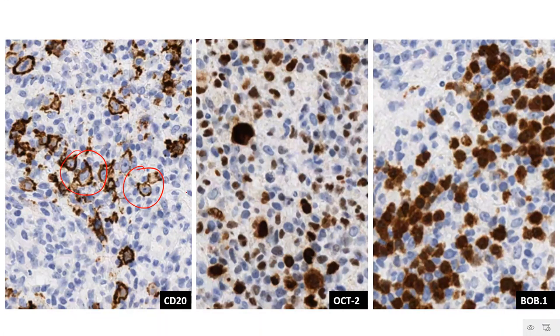To make matters worse, when you do IHC for nuclear transcription factors like OCT2 and BOB1, you see that there is a strong nuclear expression of the B cell associated transcription factors within the large cell population. So herein you have a case which looks like Hodgkin lymphoma, which expresses the Hodgkin lymphoma markers CD15 and CD30, but which at the same time also expresses at least three of the B cell associated markers like CD20, OCT2 and BOB1. Now that's more in the direction of a primary mediastinal B cell lymphoma, right? But what do you call it? So this one ends up with a diagnosis of a gray zone lymphoma.